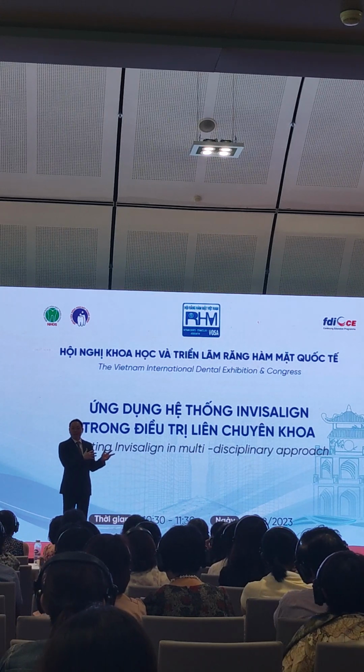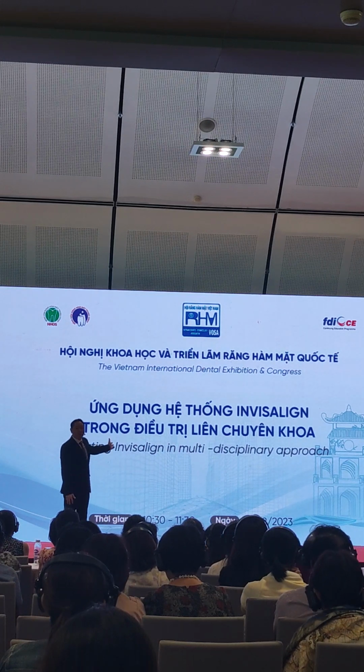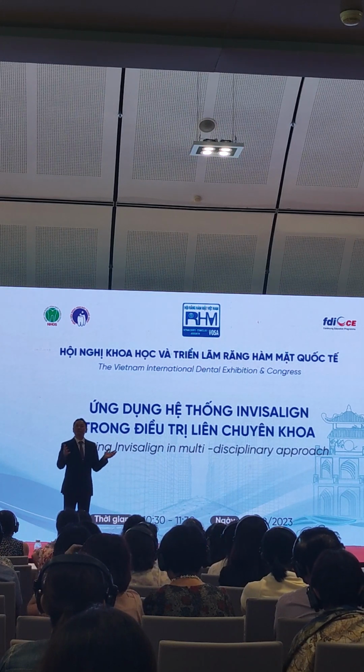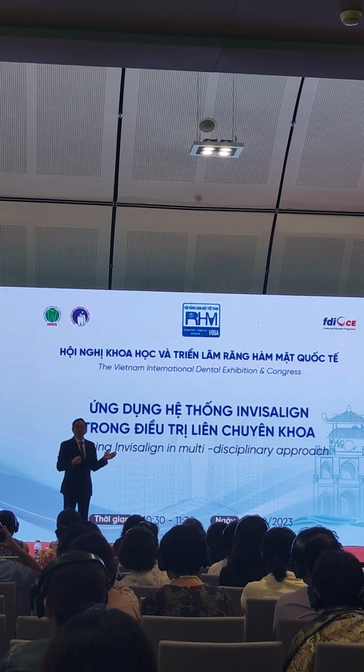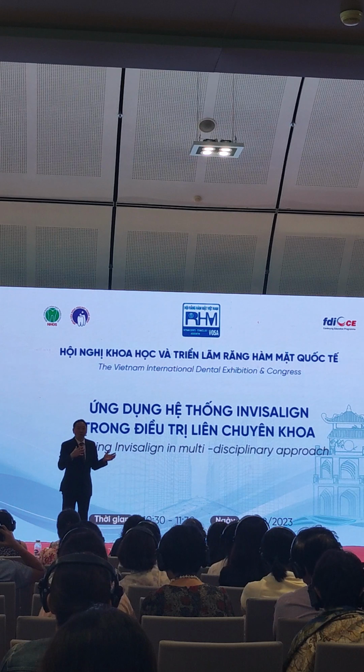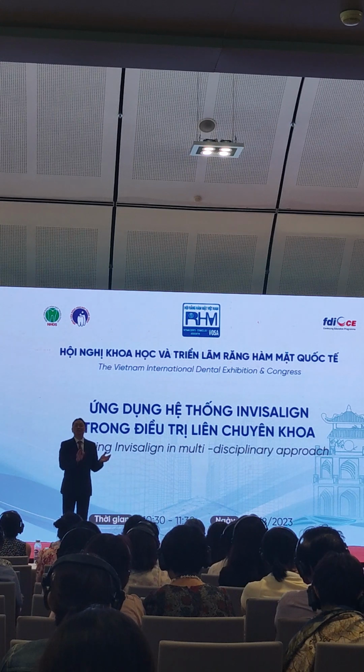That's why I don't put attachment. Of course, attachment is number 4. You get one case where I put the attachment because we need to do upper anterior retraction and also lower molar distalization together. Then we need a mini screw. I'm not rejecting mini screws.